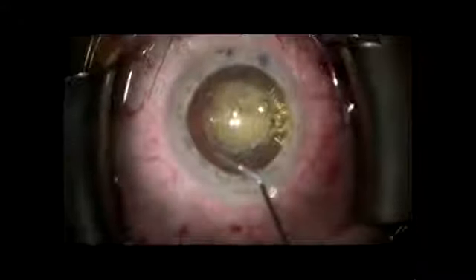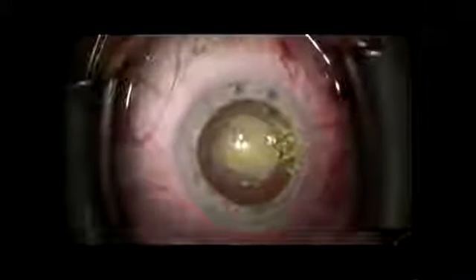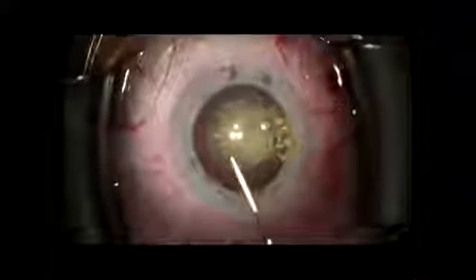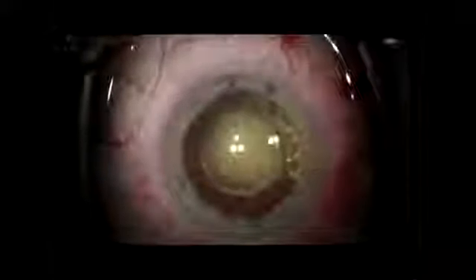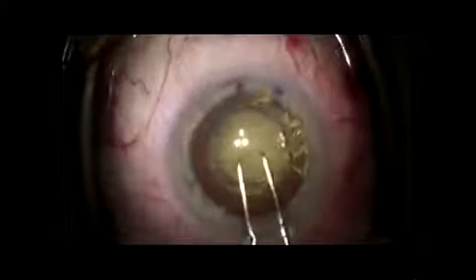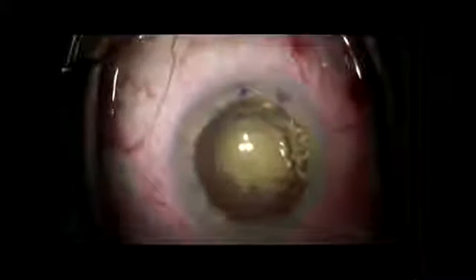The 360-degree viscodilation will treat the entire natural drainage system. Catheterizing the canal of Schlemm will break adhesions within the canal and free up herniations of the inner wall of Schlemm into the collector channels. Studies ongoing by Dr. Haiyan Gong, looking at the structure and function of the aqueous outflow system in glaucomatous eyes and also in UBM scan images, have recently shown the importance of the distal outflow channels contributing to intraocular pressure.